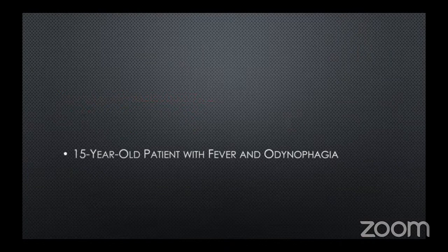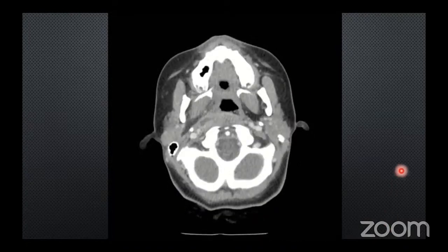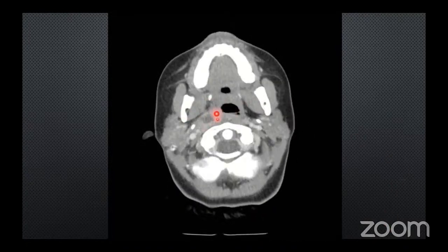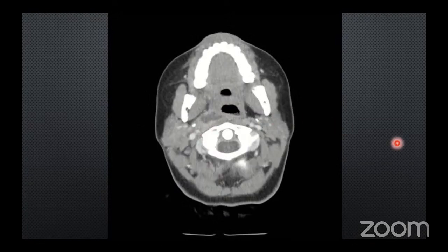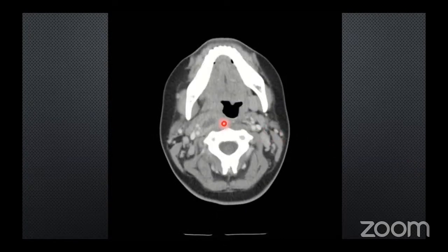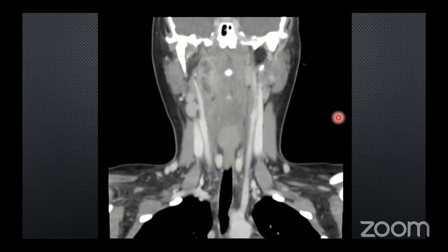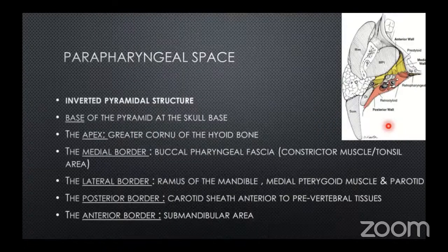Now let's look at a patient who is 15 years old and presents with fever and odynophagia. Let's look at the axial CT. The most obvious abnormality here is a lesion with a hypodense center with peripheral ring enhancement and irregular borders. Obviously, this is a parapharyngeal abscess with a little bit of involvement in the retropharyngeal space laterally. You can see it here. Most of the involvement in the retropharyngeal space is slight, but the true abscess is in the parapharyngeal space.